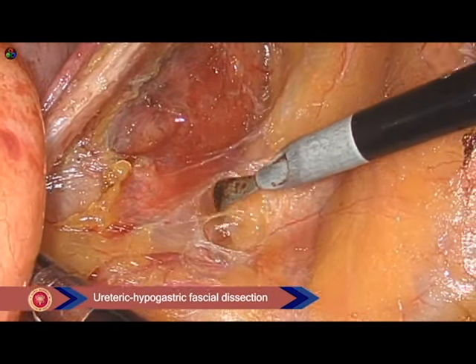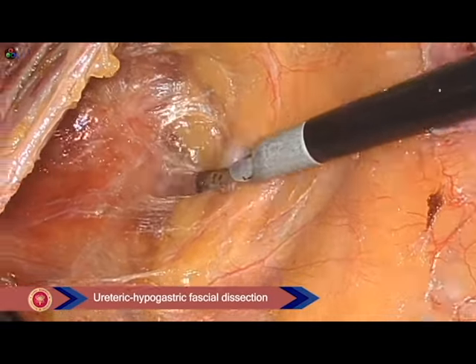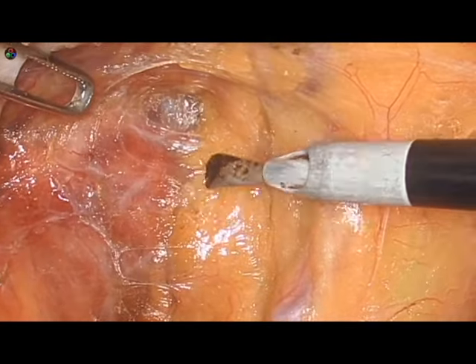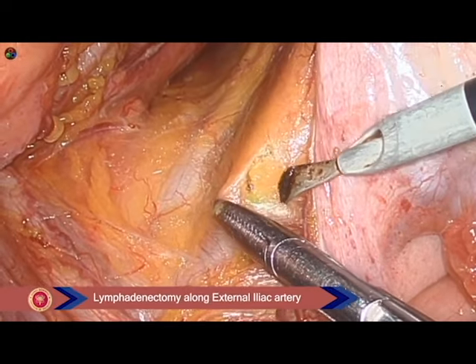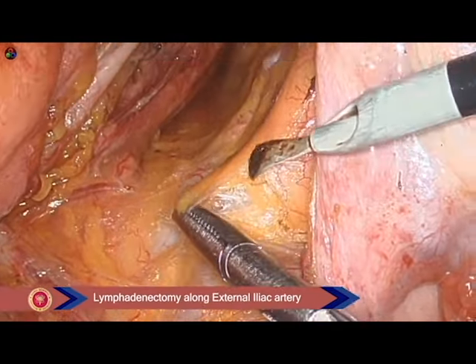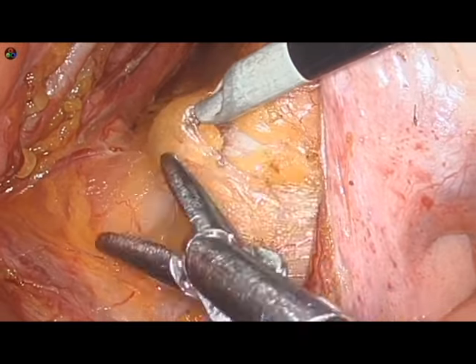The next step was the dissection of the uretero-hypogastric fascia, which envelops the ureter, hypogastric nerves, and the pelvic splanchnic nerves. The dissection then continues over the medial aspect of the external iliac artery. Staying a plane just above the adventitia ensures completeness of lymph node clearance and avoids injury to the vessels.